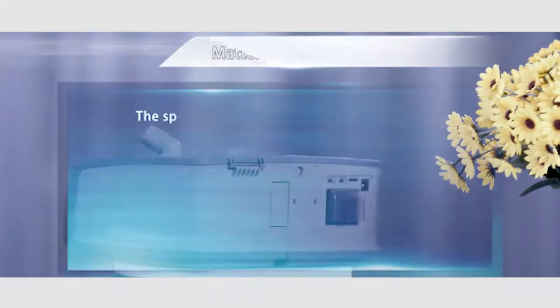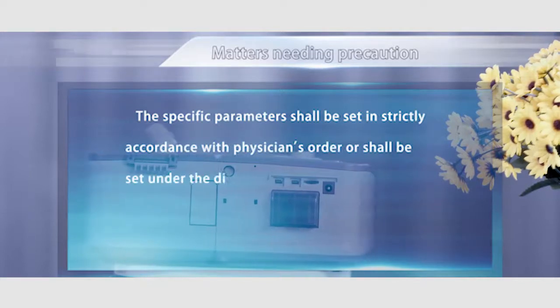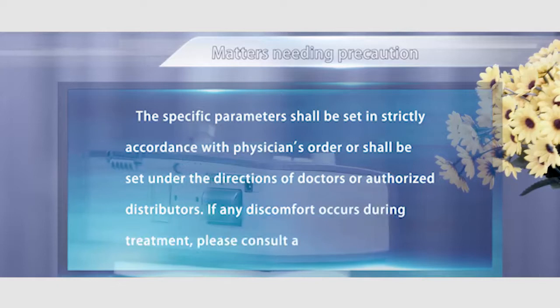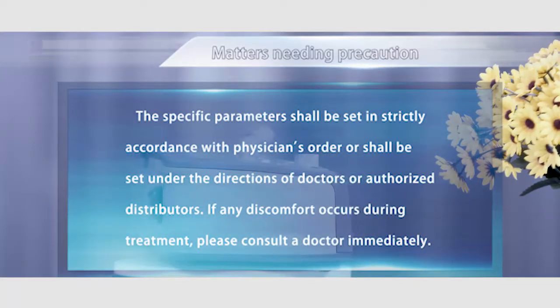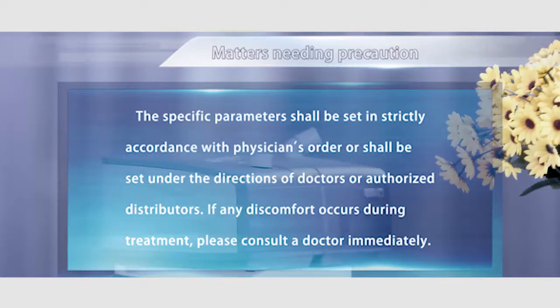Precaution: the specific parameters shall be set strictly in accordance with the physician's order, under the direction of doctors or authorized distributors. If any discomfort occurs during treatment, please consult the doctor immediately.